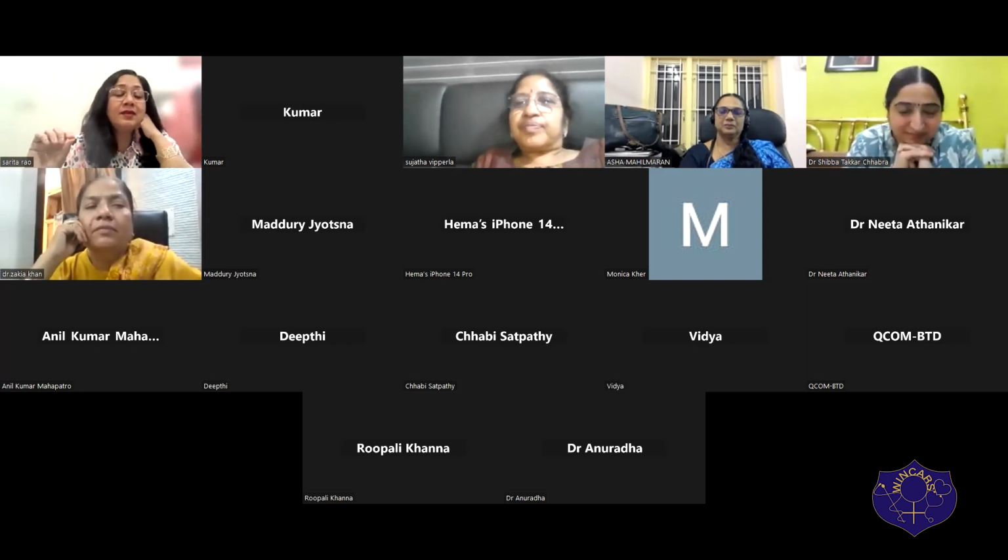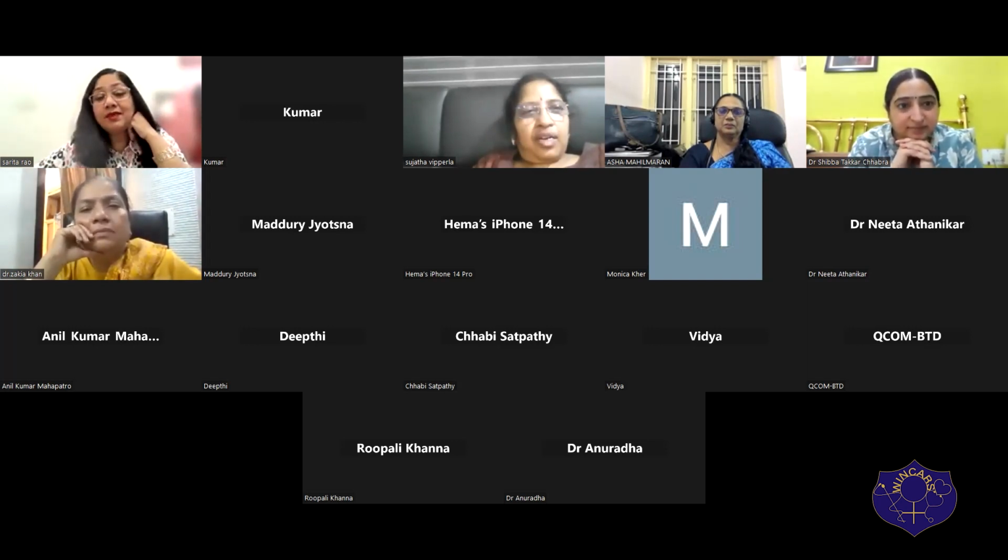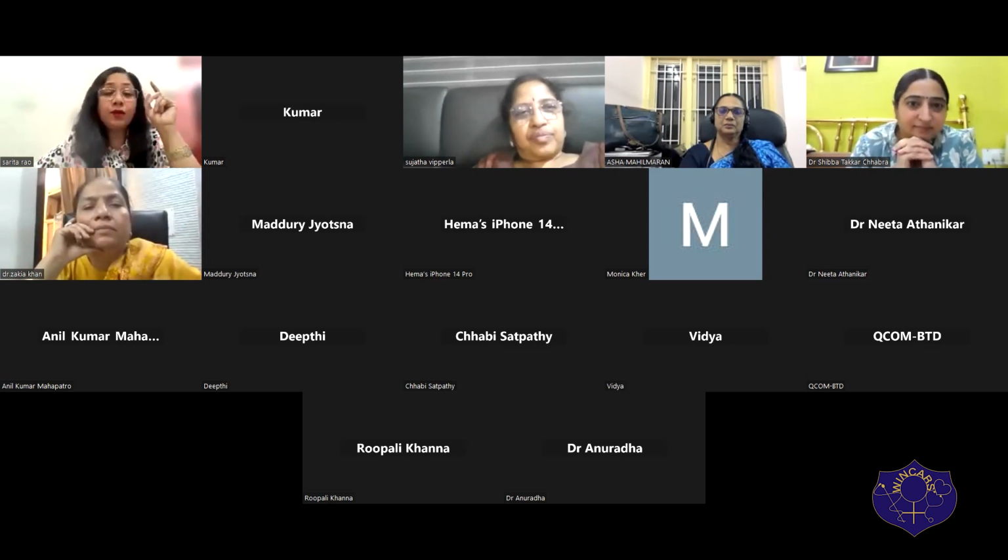Small vessels and tortuous vessels, avoid orbital. Orbital is much better suited to straighter segments. What about ostia? Is it true, Sarita? No, for ostium, there are two things.